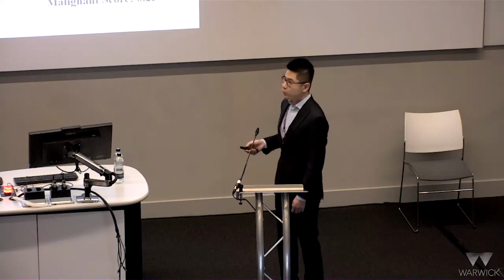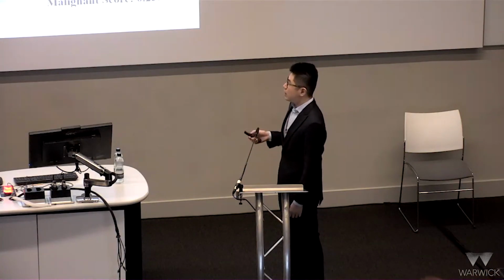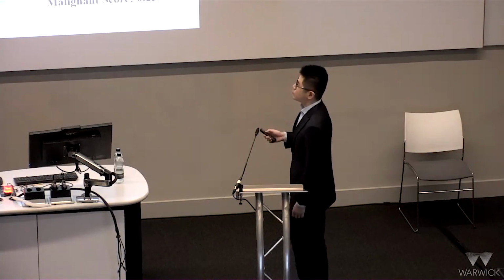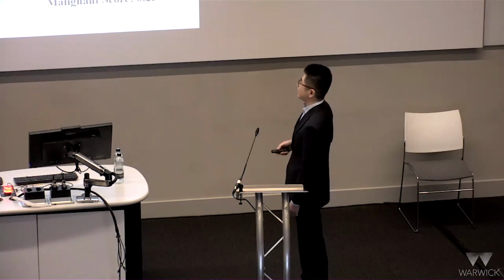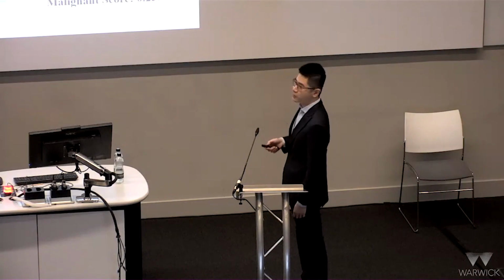Yes, it's a good question. In fact, people usually apply a mask at the boundary of the tissue. However, there are two cases. The first one is, for most of the cases, the boundary is very hard to detect, and I'm currently working on it. I believe if you mask all the background or invalid tissue, then the accuracy can be largely increased. As I said, this is just a starting point of the project, and we're working on the background issues.